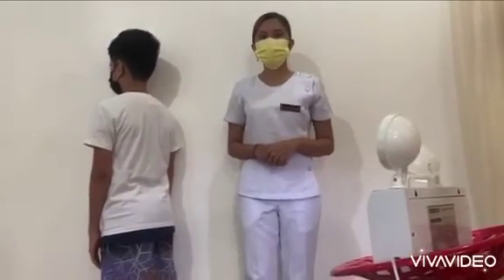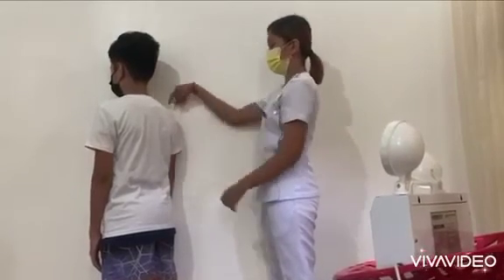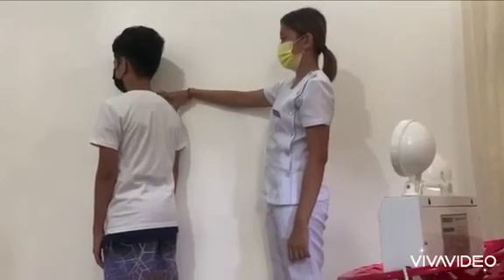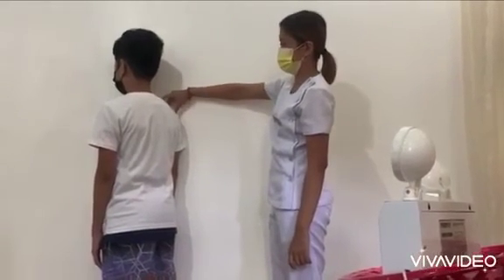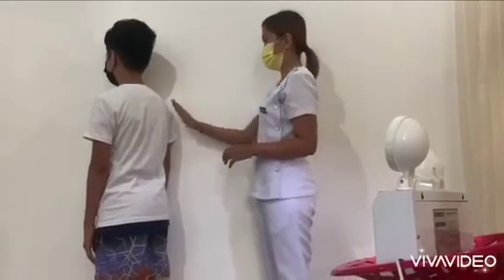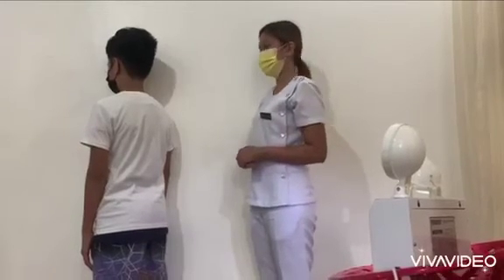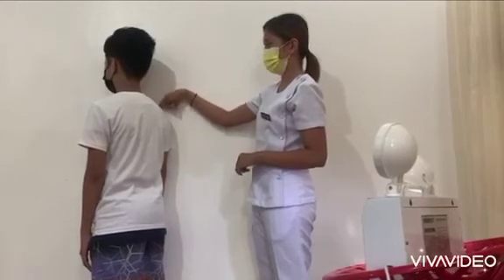Now you make sure the body of your scapula is straight. You can find the lateral end of your scapula and the acromion and make sure this line is coming straight through the middle of your fingers like this. So what I'm trying to do is get the body of the scapula lateral over the humeral head, and the superior angle of the scapula and the AC joint in a line, which will give you the scapular Y.